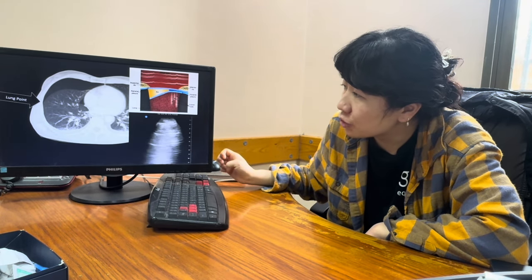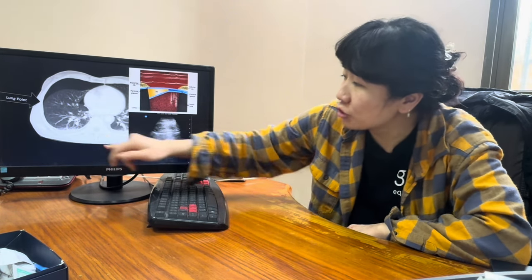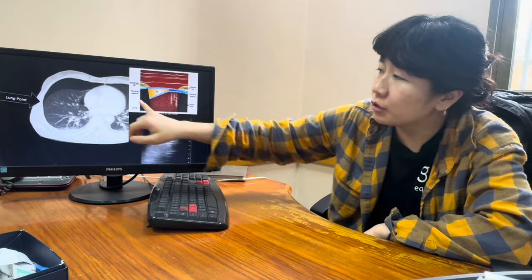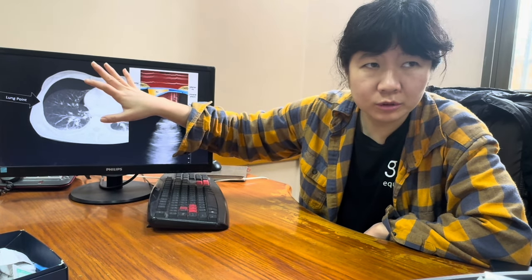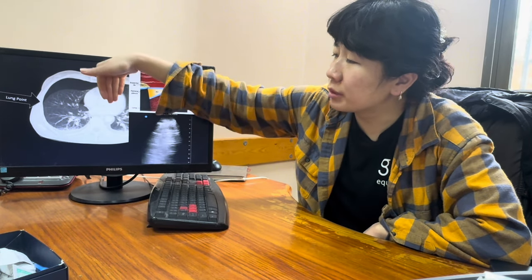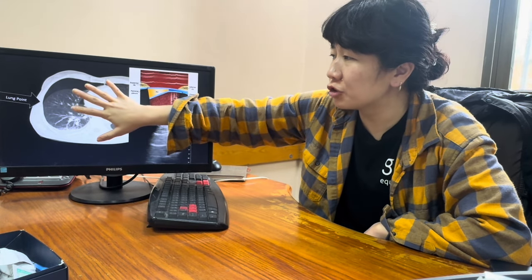Another special finding on ultrasound you can get when you're looking for a pneumothorax is something called a lung point. And if you look at the CT, this is still the definitive testing to look for pneumothorax. It's the most sensitive, right? But you can tell that with ultrasound, you're looking at one place in time, on one part of the patient, whereas the CT will show the whole area. This is our three-dimensional view of what's going on.